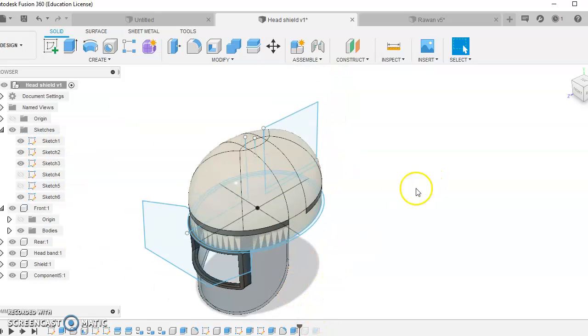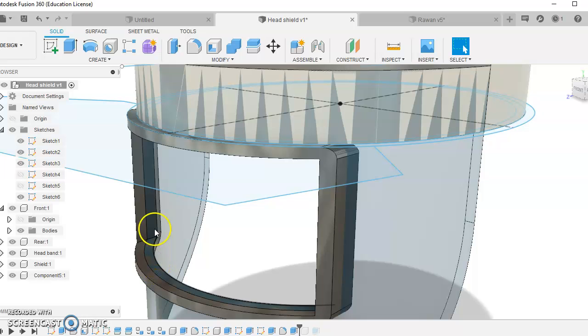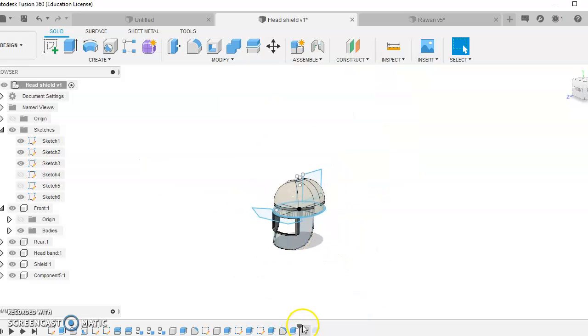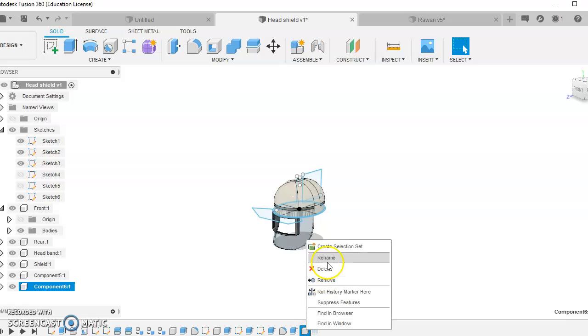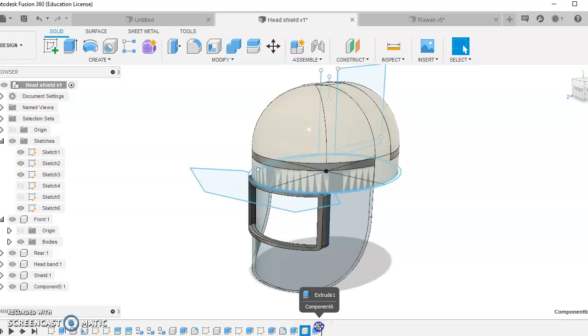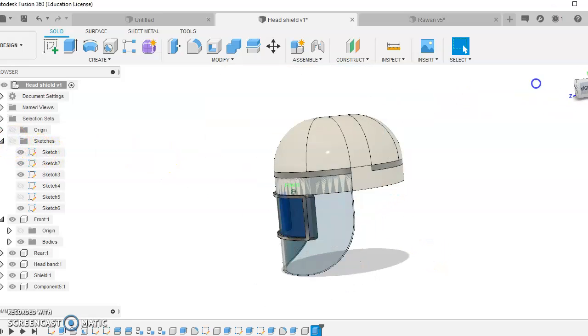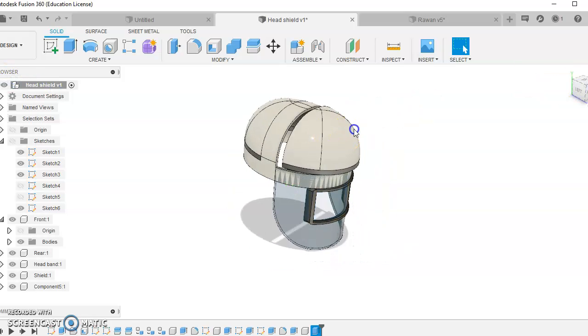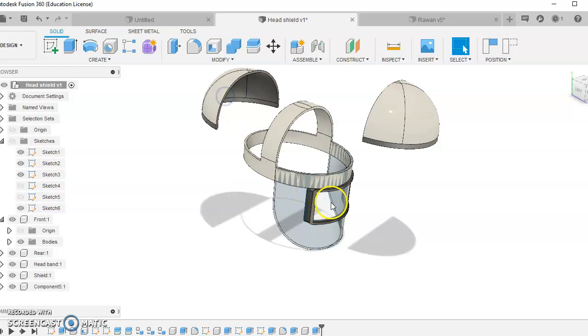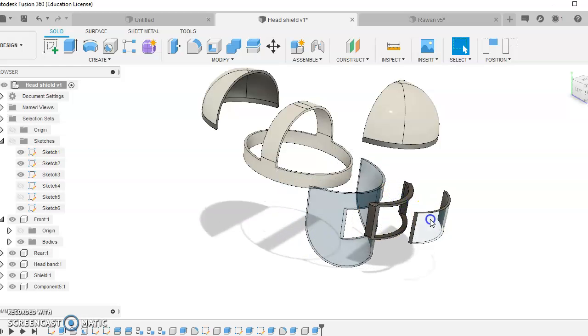And the really good part about the next piece is quite clever. If you zoom in on this area here, I can actually select that edge and create a shield. So I don't have to worry about manufacturing it. I just use that element there, extrude, and then turn it into a new component. And I'll just show you what it looks like on here. Okay, so on this section, I would have extruded it, and there is the window. So if I turn all the sketches off, what you can see now is a representation of that. So I've ended up with 1, 2, 3, 4, 5 components from one drawing.